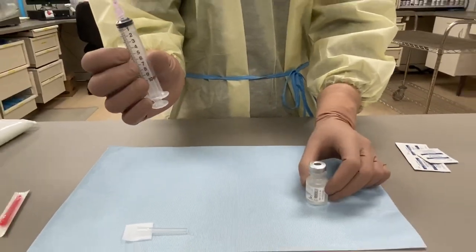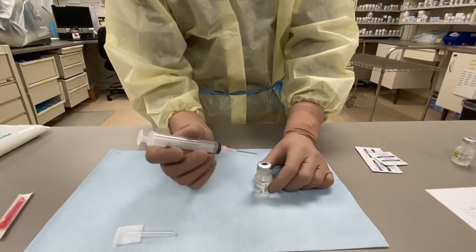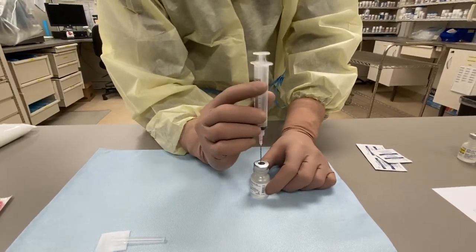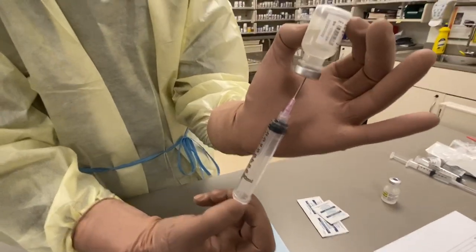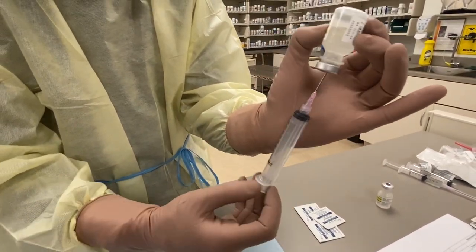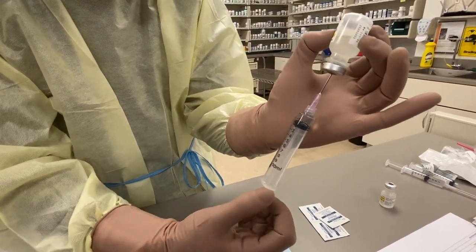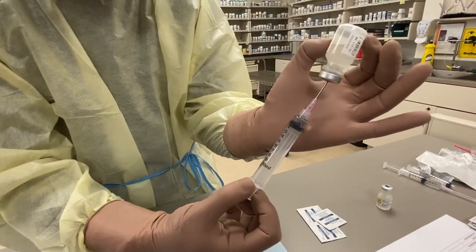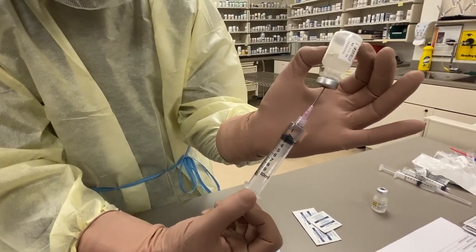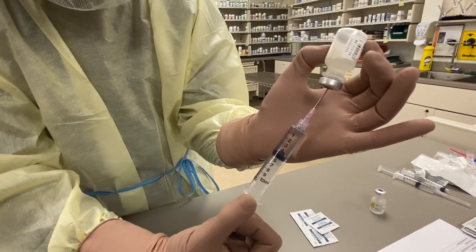I will not be drawing any air into my syringe. I'm just trying to get rid of the bubbles here in the initials.